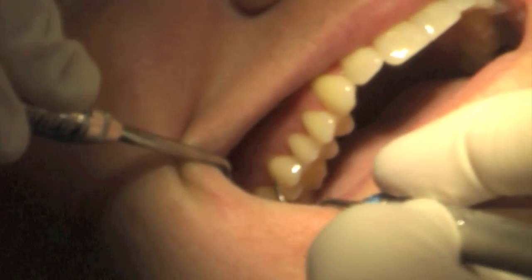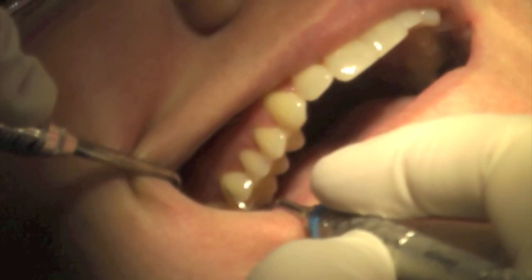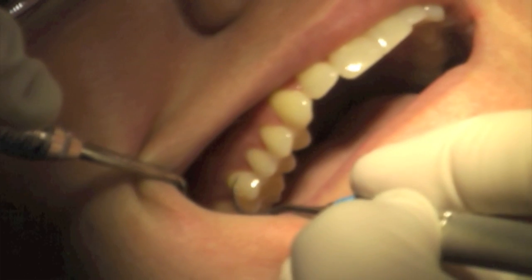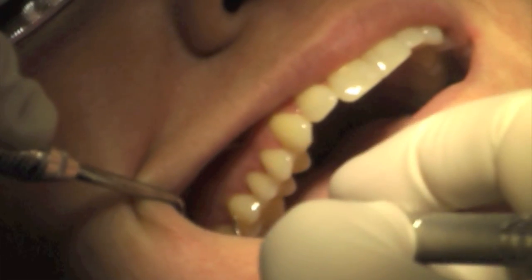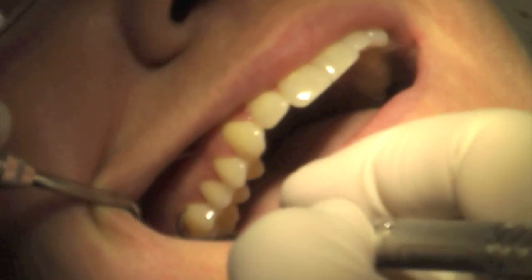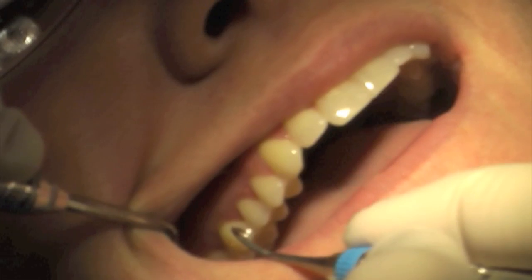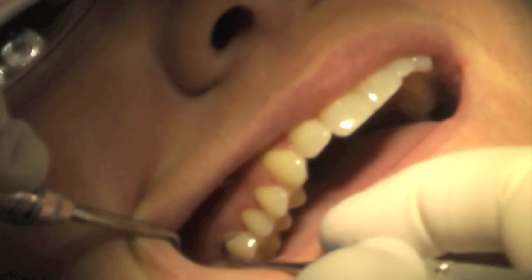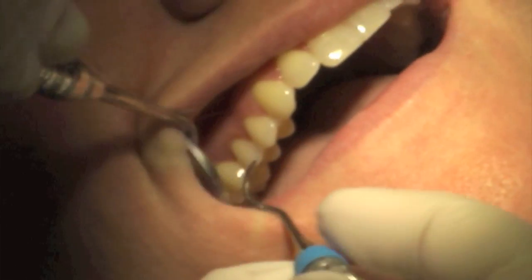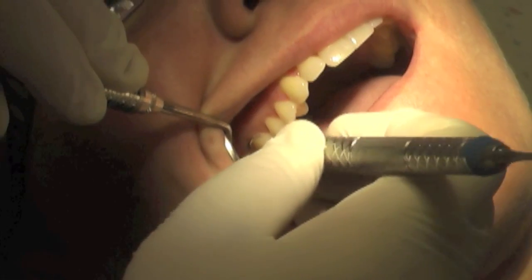Even if you have to practice above the gum line — if the instrument is sticking out into the gum line, that's going to be painful. So keep that toe third and just walk it around, walk, walk, walk, and do whatever you have to do to keep it in total contact with the tooth at all times. Angulation is going to help keep that in contact, because if my angle is correct as far as my stroke, I'm going to be able to stay in close contact. If I'm flat on my fulcrum and not doing what I should be, then your toe isn't able to stay in close contact.